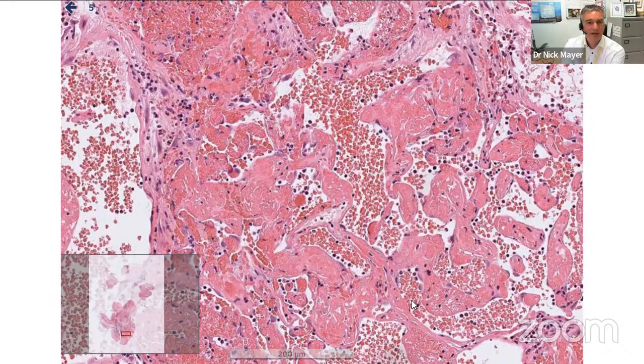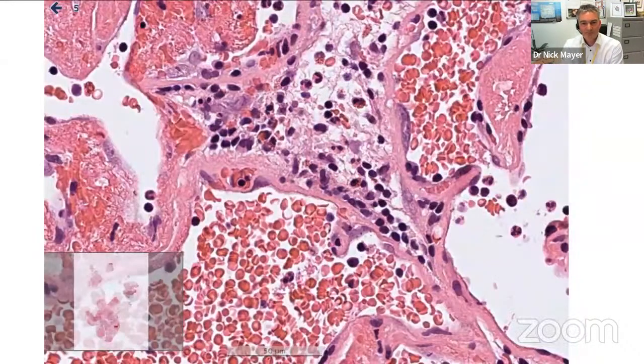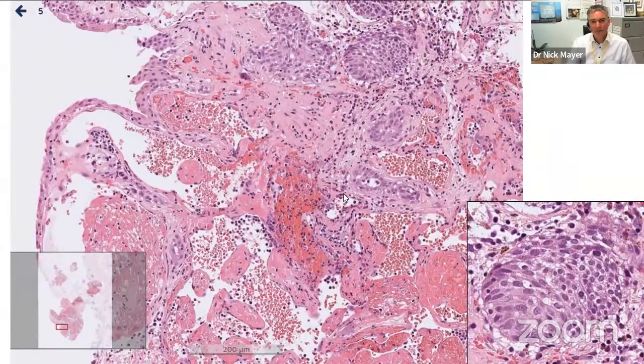So papillary endothelial hyperplasia type change. And some of the lining endothelium in these areas was a bit tickled up, although not frankly malignant cytologically, but certainly a bit tickled.